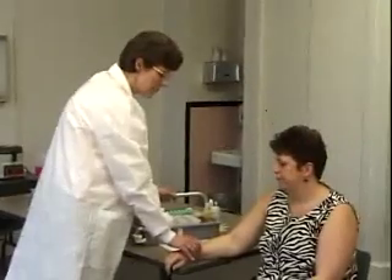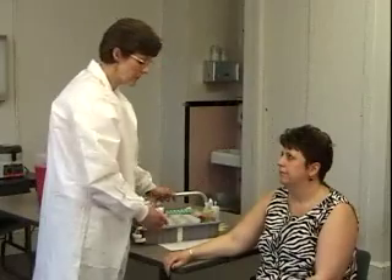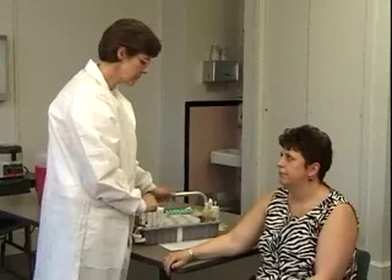If she were an inpatient, I would actually check her hospital band and make sure that all the numbers match the request form, so that we can compare exactly and make sure that every number is right and every letter in the name is spelled correctly.